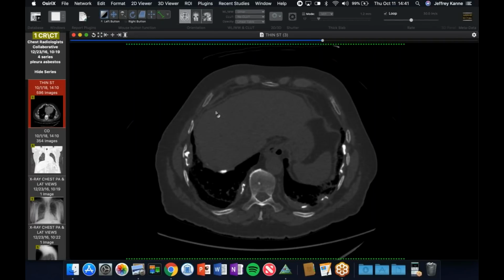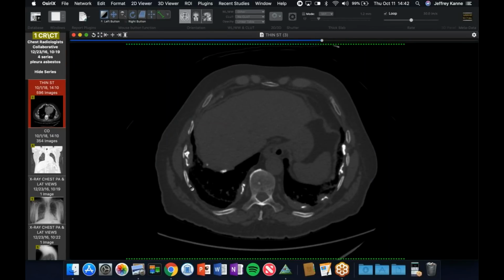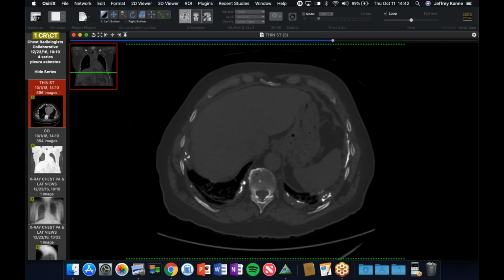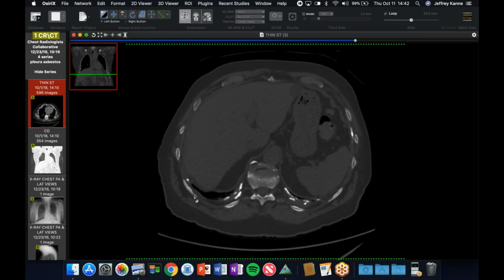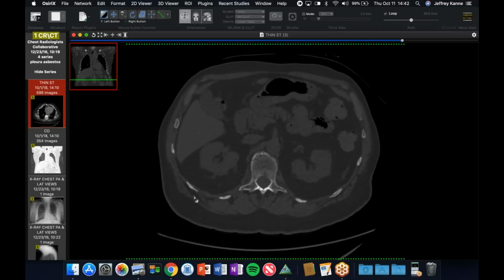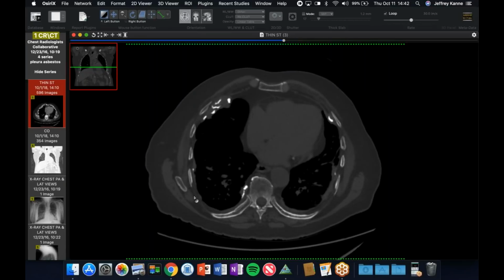And then what we noticed, and I'd never seen before, and my colleague Chris Meyer, who's been doing a lot of occupational work over his career, has said he's seen it one time, and it was an isolated one, raised enough concern that they actually biopsied one years ago, is this remodeling of the rib. You see this plaque extending into the extrapleural space and causing this pressure erosion of the rib. Now, the good news is we have a whole bunch of these here, and you can see there's one posteriorly on the right. So this would not be typical of a malignancy, but rather just the pressure erosions.